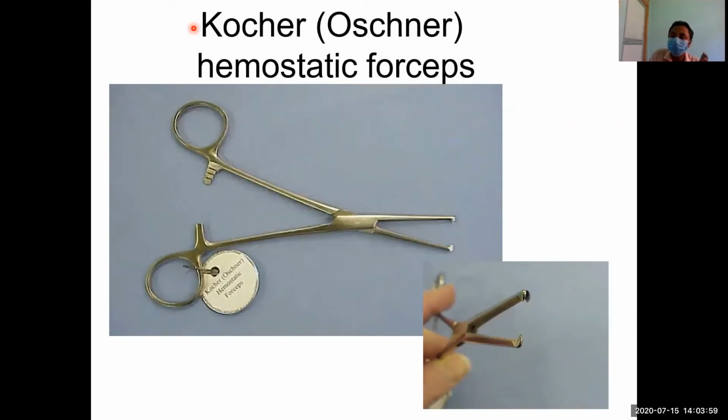While doing a thyroid surgery, there is a vessel you will come across, the middle thyroid vein. It is a very short vein, with less space to manipulate, and it opens directly into a very important vessel, the internal jugulars, right and left. So he developed this instrument to hold that vein as well as to hold the thyroid. It is a very vascular structure, so while operating, it bleeds. To hold the isthmus while doing a partial thyroidectomy, he developed this instrument to hold the middle thyroid vein.